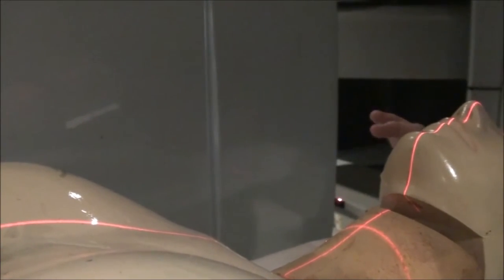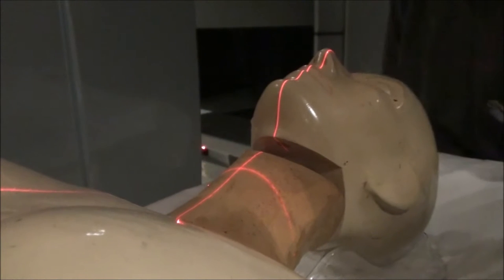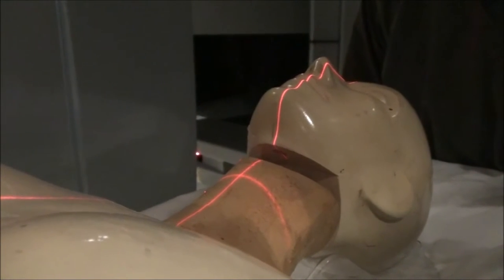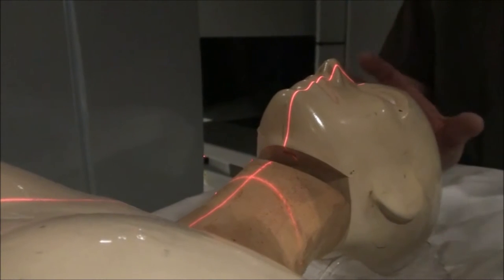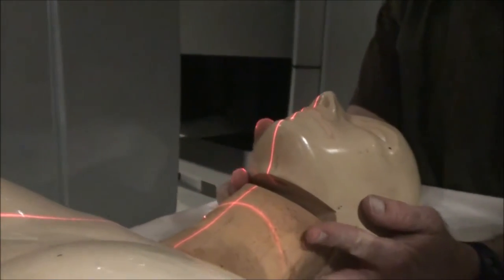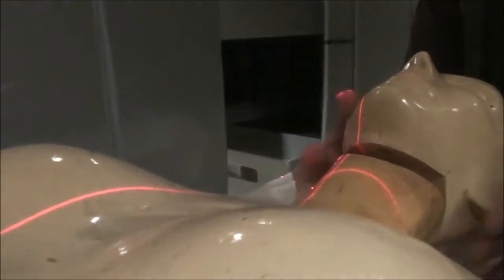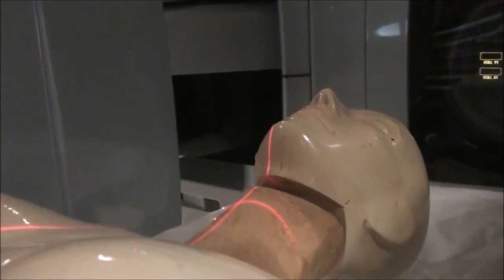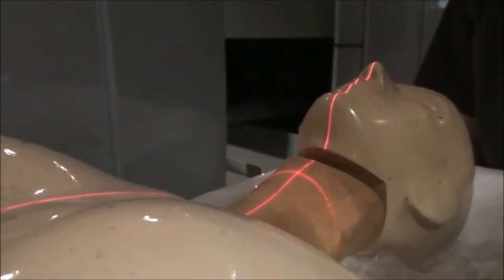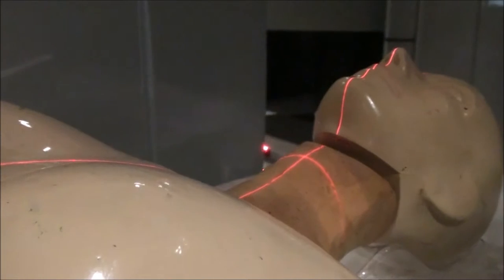For either method of simulating, this person is now ballparked — left, right. Actually I can see she's not straight. I broke one of my major rules. I did not get the patient straight with the laser — from the crotch, xiphoid, SSN, chin, nose, glabella. Major sin right there. So now I've got her straight. I still have my flash, thyroid cartilage, cricoid cartilage, anterior flash, and probably splitting the vertebral bodies in this particular case.